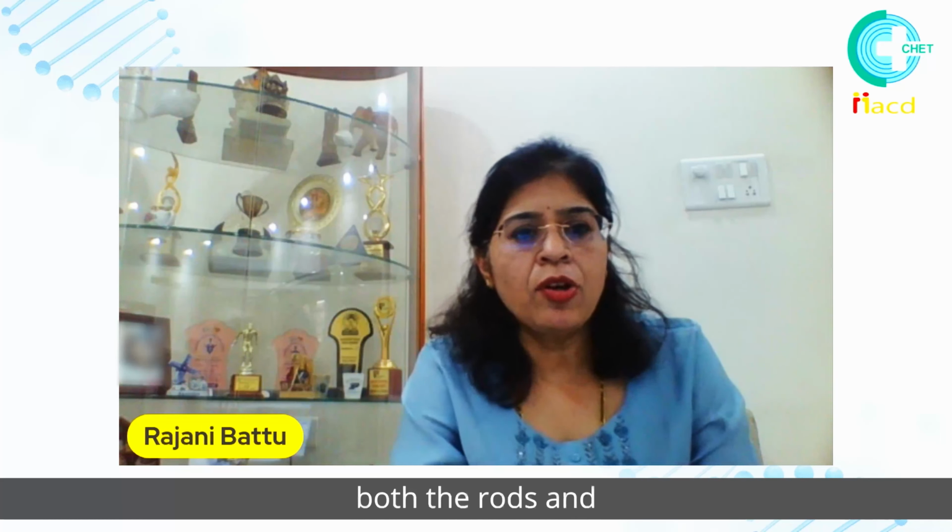So, for example, in a child with, let's say, retinitis pigmentosa, a disease that affects the rods first more than the cones, some parts of the ERG get affected. In LCA, for example, both the rods and cones get affected. So in a nutshell, it's not very difficult to make a diagnosis.